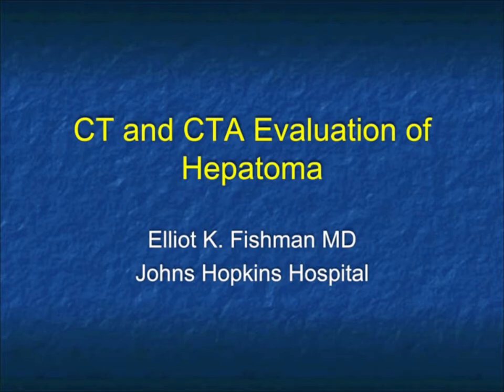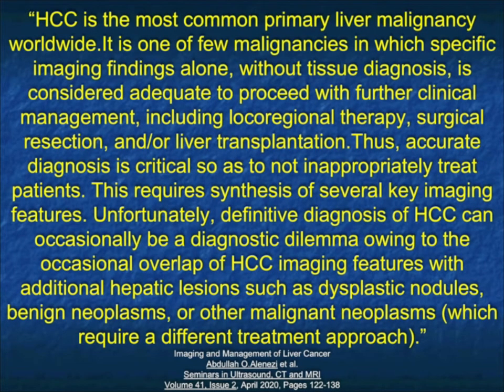And this is going to be a talk on hepatoma. What I'm going to focus on in this talk is just a description of hepatoma in terms of CT, how we optimize detection, what the various appearances are, and how you could differentiate hepatoma from other hepatic lesions, both malignant and benign. This is a new talk, and I think it's going to be two parts, so stay tuned and let's get started. A number of articles.